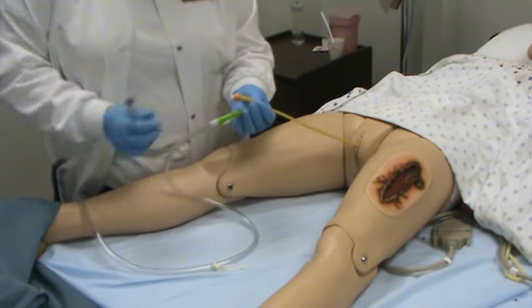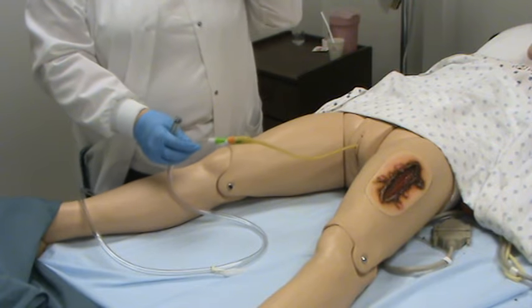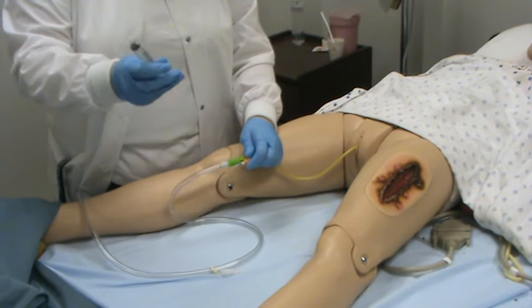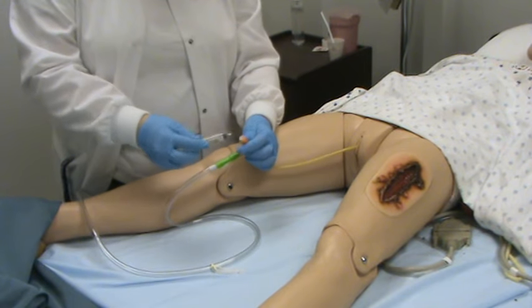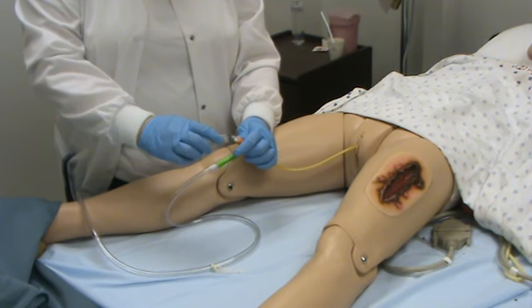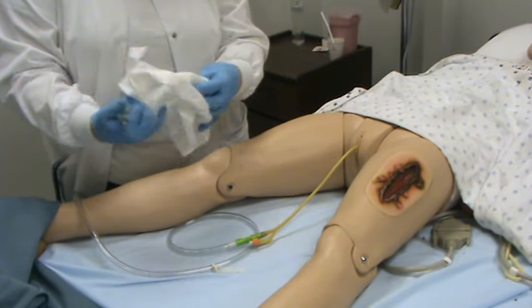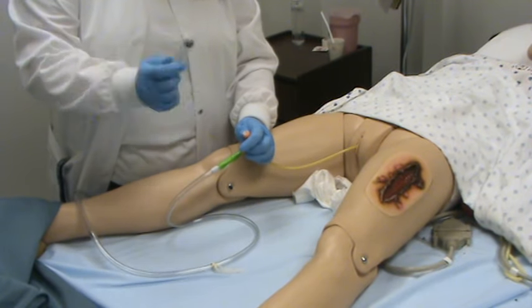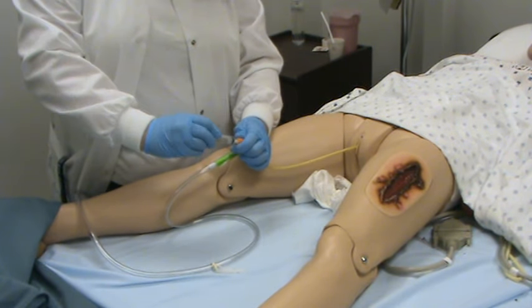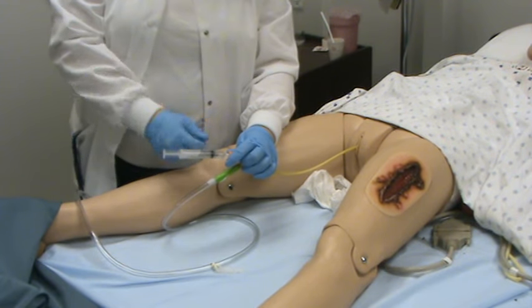First, you want to know how many cc's are in the balloon tube. The nurses should have it charted at the nurse's station. If they do not, take a 10 mil syringe and make sure that you prime it. You don't need to use alcohol since the Foley catheter is coming out. Have a Kleenex or paper towel available in case any urine should dribble. Insert the syringe into the port and, if you have primed your syringe, you will notice that the fluid comes back.